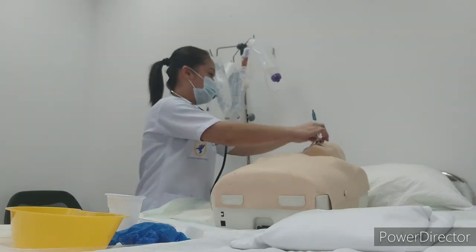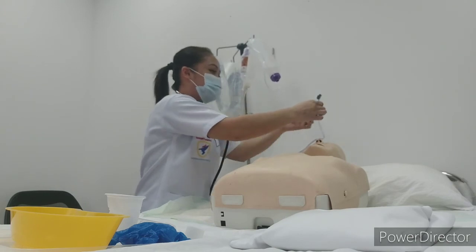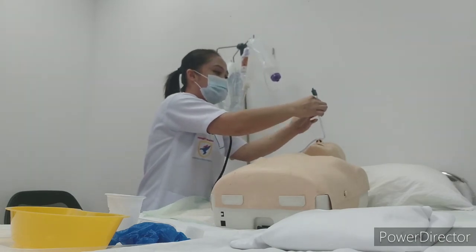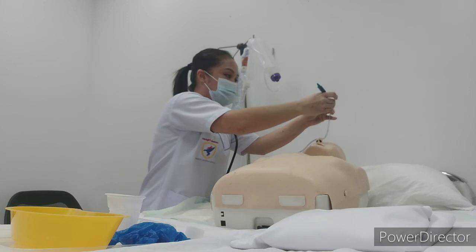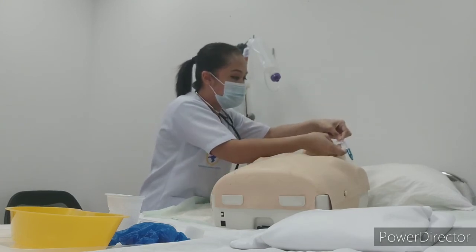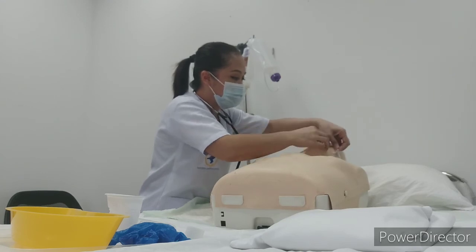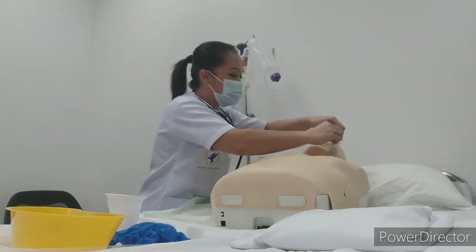So this one we will put like this, here in the butterfly, and then under the cheek of the patient. Not to cover the eyes of the patient.